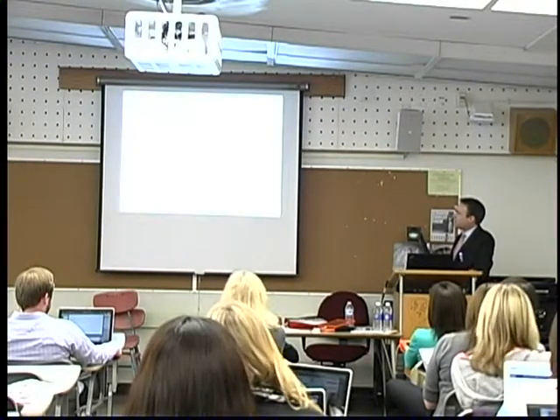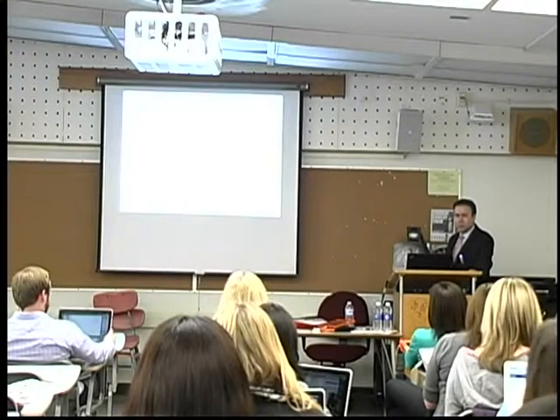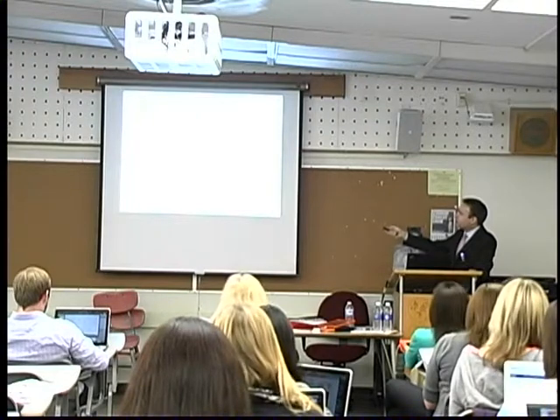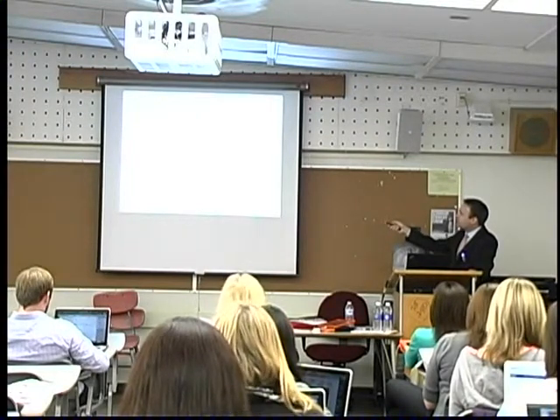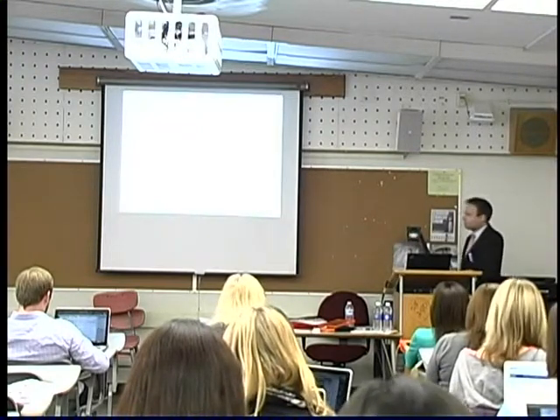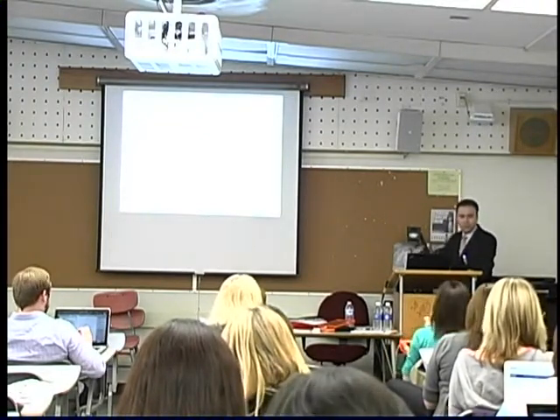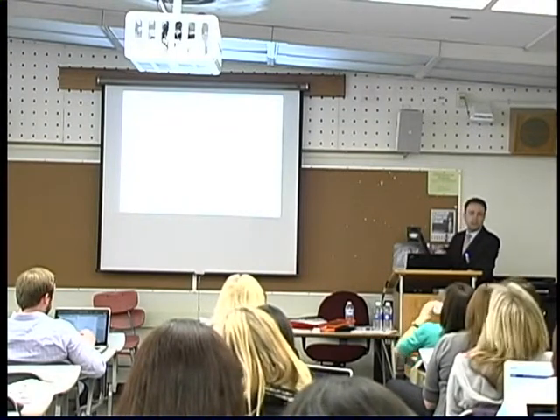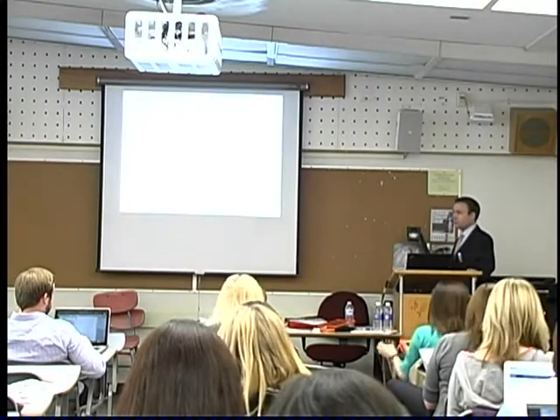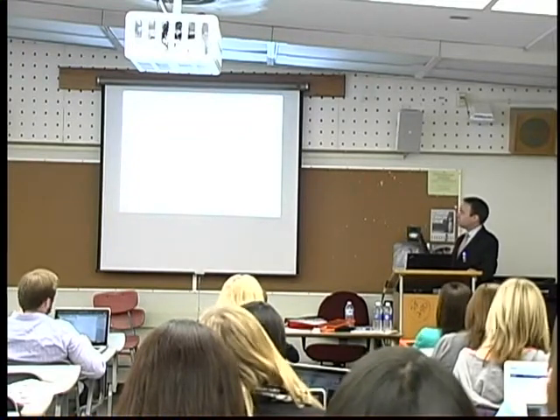We thought there might be a need for a very simple light app that's composed according to these sensory processing characteristics in autism learners. Like I mentioned before, many of them have this issue of filtering out salient and truly important stimuli from a stimulus-rich environment. And for the beginning communicator with autism, graphic symbols should be carefully chosen. We know that these individuals are very strong with visual learning, but the symbols that need to go on their devices and on their communication boards need to be strong representations of what they stand for. If those symbols are too abstract, the chances are you make learning more difficult for them.